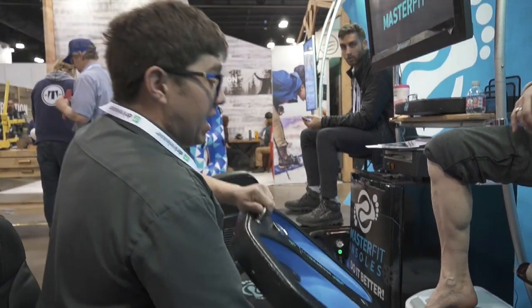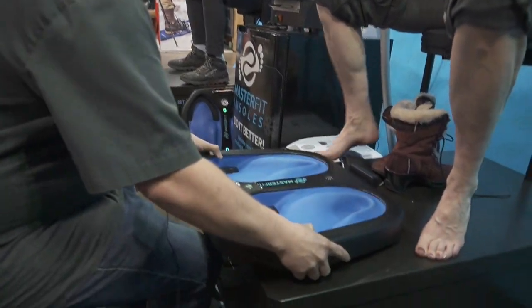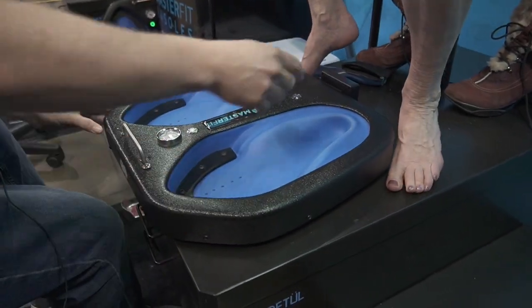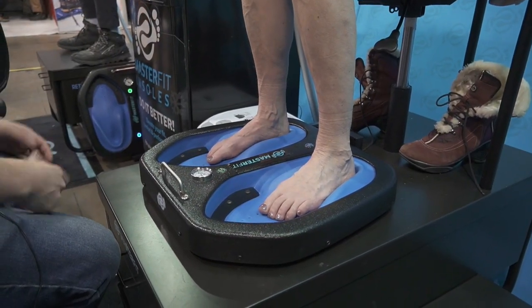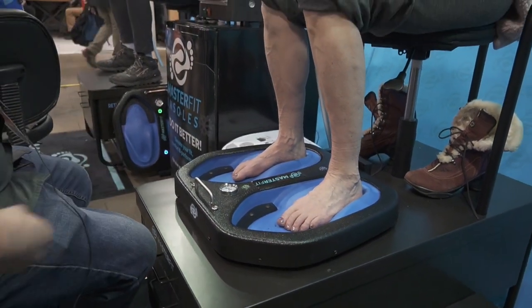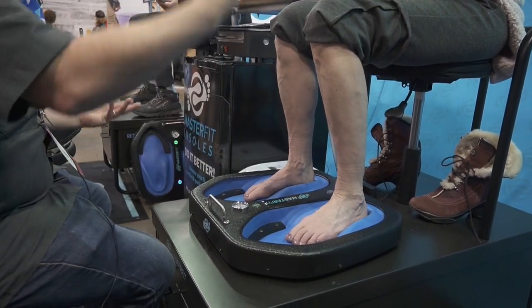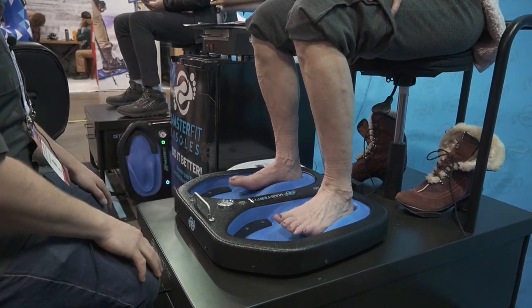We're going to get you some new footbeds today and replace what you have. First things first, I'm just going to slide this underneath your feet right there. Take your time, and when you're ready I'll just let you drop your feet right in here. When we're going to cast you, the best position for you to be in is nice and upright. What we're looking for is hips, knees, and ankles all at 90-degree angles. That's going to put everything in the most neutral position so we can get a good quality cast.